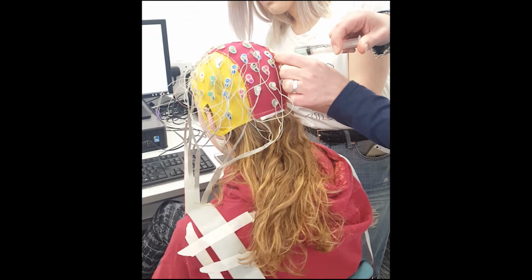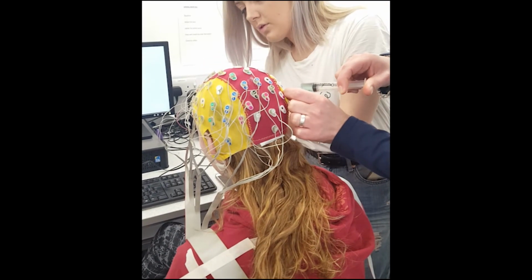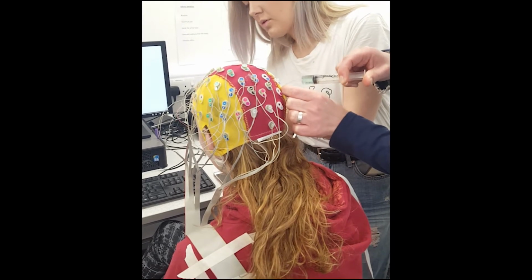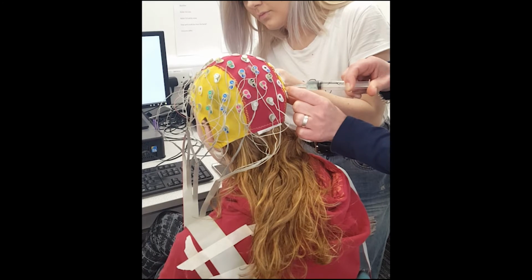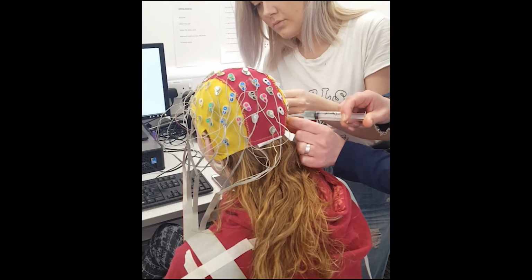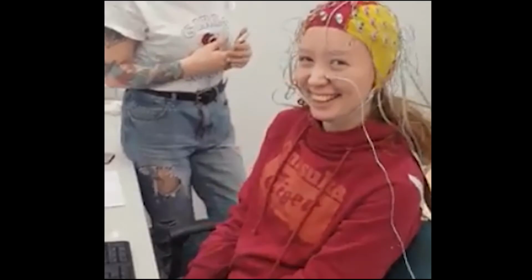When electrodes are being placed on the scalp, a blue light will be present if everything is okay. If the blue light flashes, the electrodes need to be repositioned until the flashing stops. Once all 64 electrodes are placed on the cap, and 2 electrodes, also known as auxiliary electrodes, are placed directly above and under the left eye, the experiment can begin.